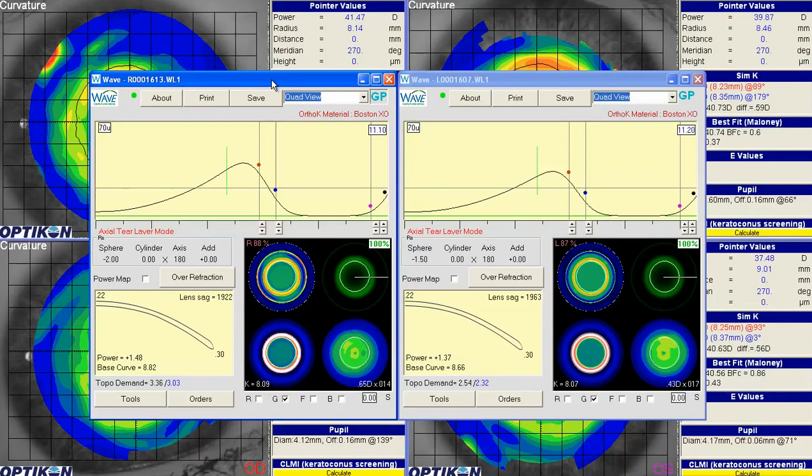But how I would go about the case is to redesign a new lens. Don't change the power. And we want to accommodate for the increased myopia in the power of the lens or the total demand of the lens itself. In the right eye, I believe we had a diopter of myopia, residual myopia. So the power of our new lens should be 2.48. And whether that's a G-SIM lens or a free-form lens, we just want to increase our target power while maintaining our original baseline refraction.